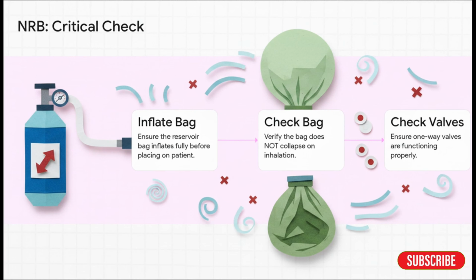You see that reservoir bag? It has to stay inflated. If that bag collapses when the patient takes a breath in, it means your flow rate is too low. And what's happening? They're rebreathing their own CO2. They are literally suffocating. This is a non-negotiable life or death check you have to make.